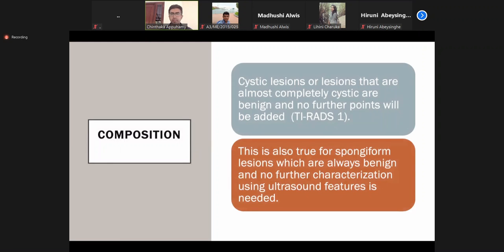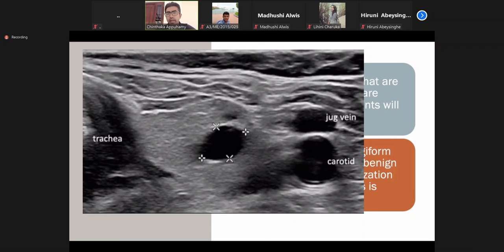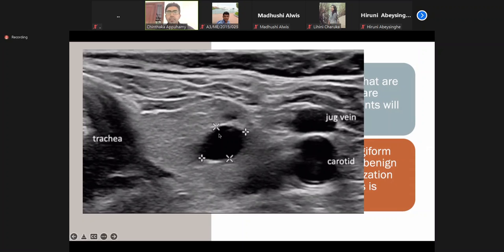Composition. This is the appearance of a cyst — you don't have any signal inside; that is what you call anechoic. This is the trachea, the left lobe, and a cyst. A cyst is an entirely benign finding; no further evaluation is needed.